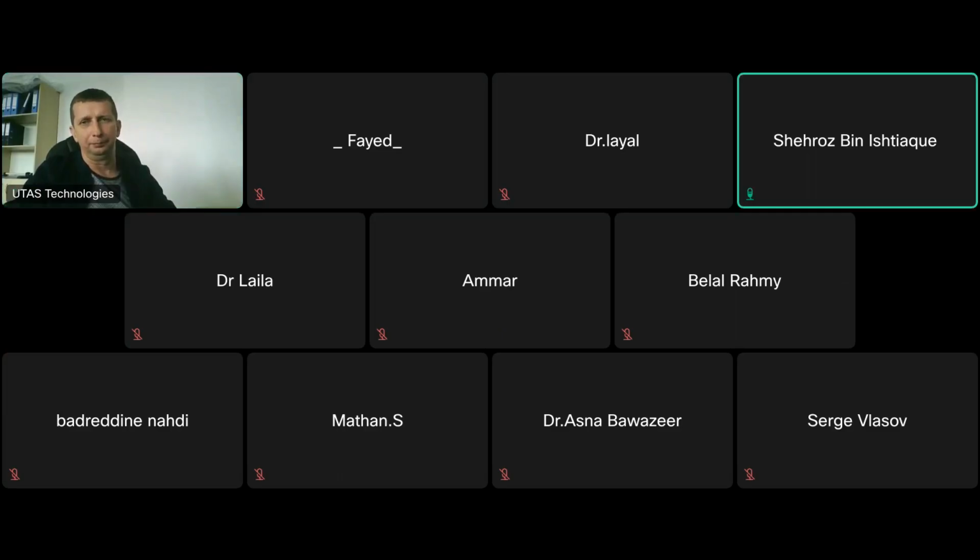What temperature should we use for the sterilization of these things? You can refer to the user manual, where you can find a chapter on cleaning and sterilization, and there are examples of sterilization and cleaning for each and every part of the breathing circuit, the flow sensor and PEEP valves. Thank you so much. You're welcome.